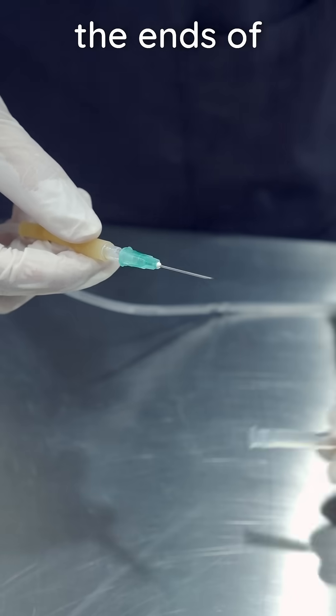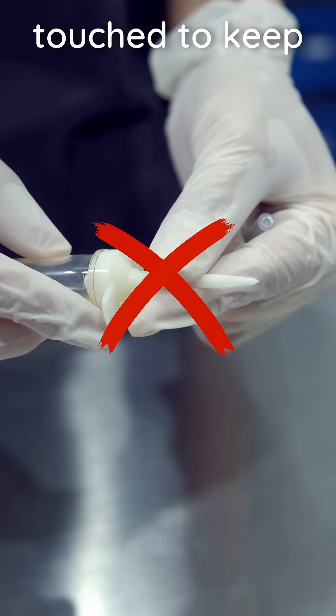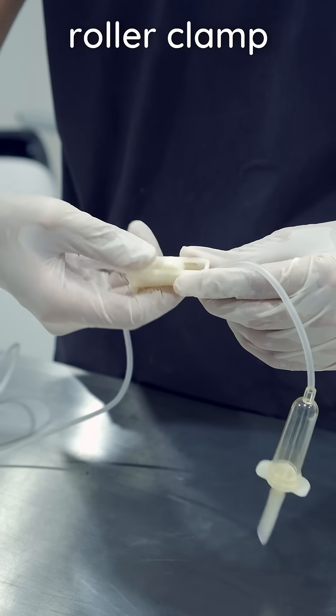Ensure sterile parts such as the ends of the set aren't touched to keep them sterile. Move the roller clamp to the closed position.